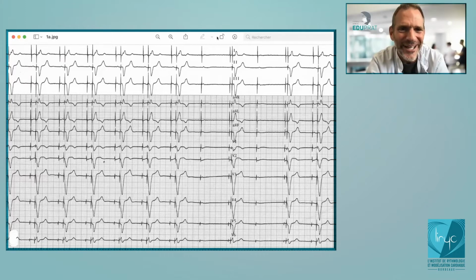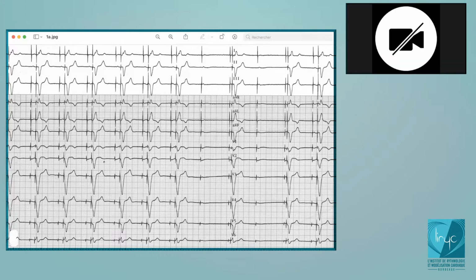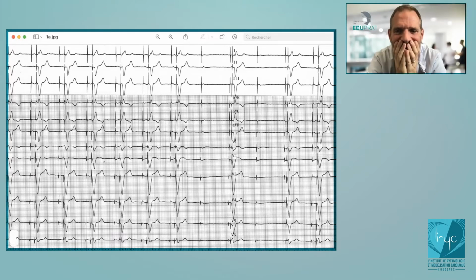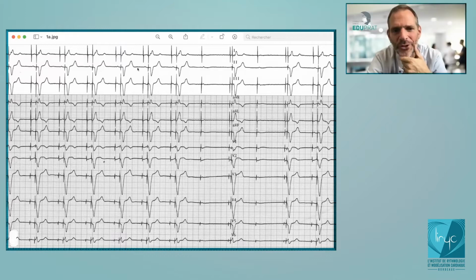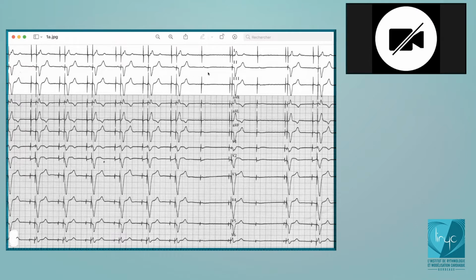I think you're right. Why? Because this trace shows the MVP algorithm and how it works. Yes. Actually, trying to let the patient's own rhythm go after the atrial stimulation. So here you're functioning in DDD, agree? Pacing the atrium, pacing the right ventricle. And then what happens here? It is looking for a spontaneous ventricular rhythm.